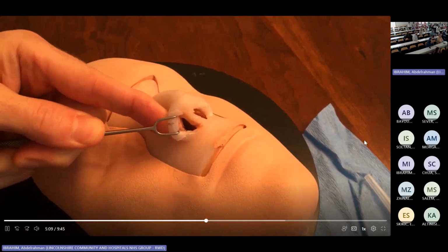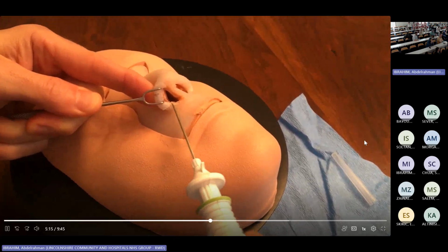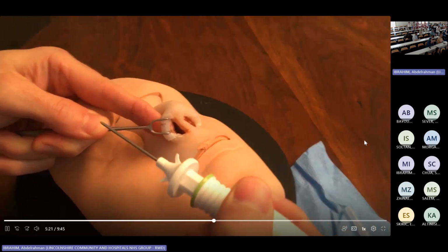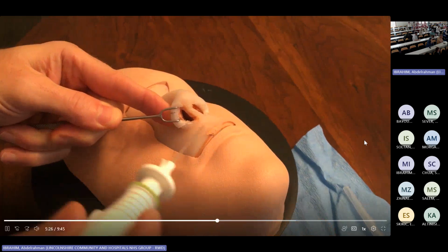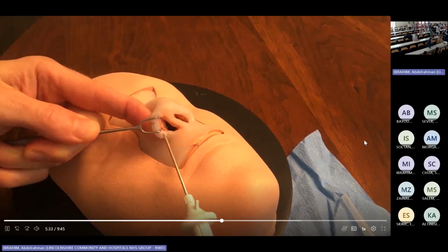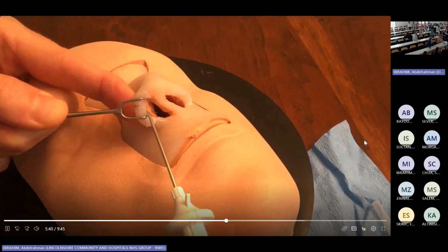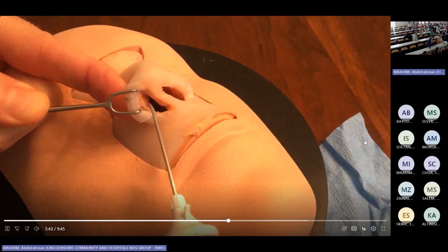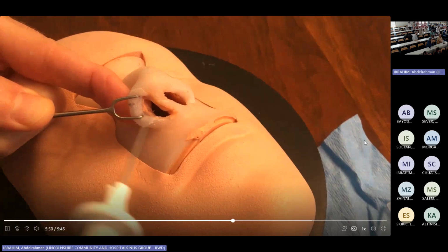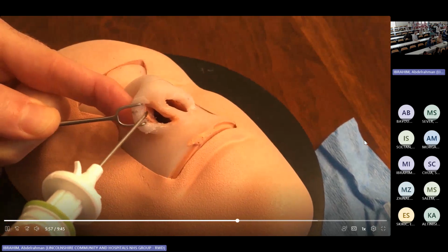At this point, I'll be ready for the second P, pierce. I'll take my delivery device. I will position the delivery device with the bevel towards the septum, which means the Latera logo is lateral to the patient. So with the bevel towards the septum, my pierce point is going to be caudal in the vestibular lining. So in the head model here, you have the rim of the ala, which is the silicone portion. So this is the bulge. You have the color transition to the skin, and just where it starts, the pinkish skin color is the vestibular lining. So caudal in the vestibular lining would be pierce point right here.